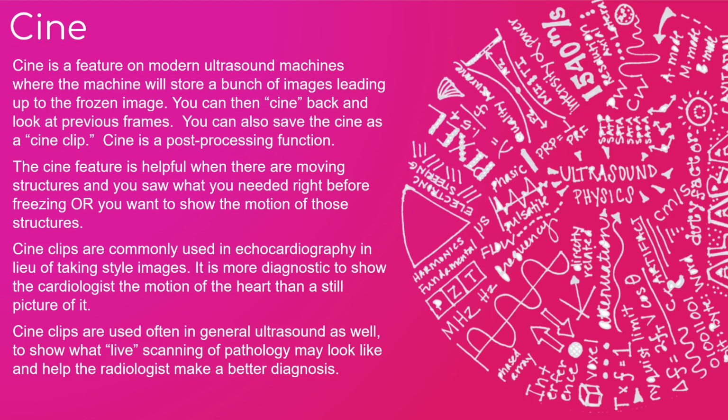As a new sonographer, I do encourage you to not rely on your cine. So often I see students like, oh, I think it was back there, and they just scroll and scroll and scroll. If you're scrolling that much, just get a new picture. As a sonographer who's been doing this for a while now, I actually really rarely use my cine clip unless it's a motion thing where maybe I saw a gallstone for a second and then it was gone. Oh, I'll scroll back to where I saw it for that second. So general uses it more as I saw something, I gotta get back to it.